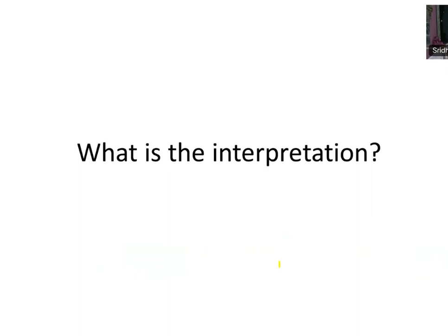So what is your interpretation now? You did the molecular method, sequencing, and proved it is positive. Then what is the interpretation? Will you call it glioblastoma? No, sir. Will you call it oligodendroglioma? No, sir. So it remains an IDH mutant astrocytoma, at least grade 3. You have not done CDKN2 deletion to call the grade.